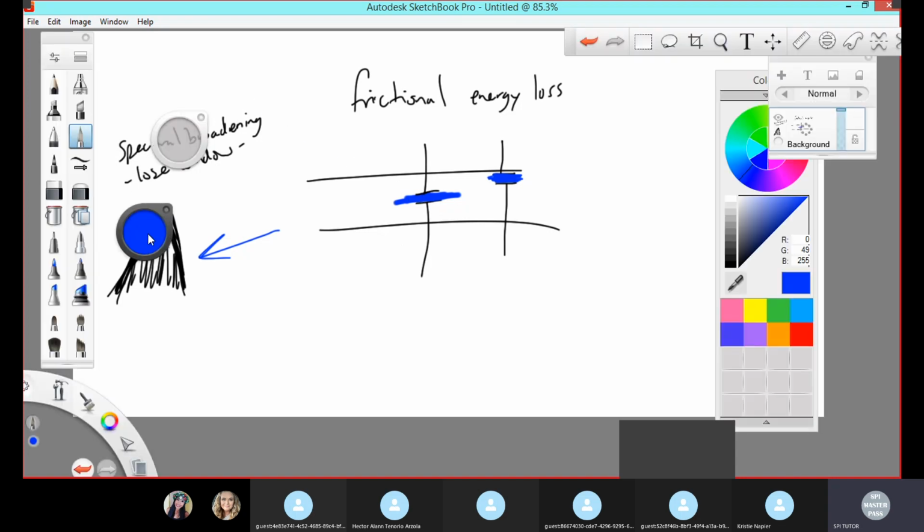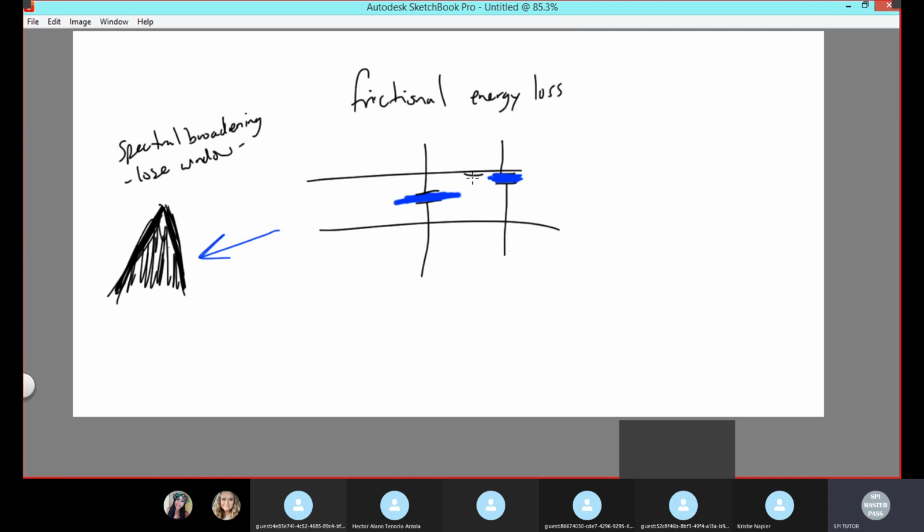Or another example is when you make your sample gate very big. Now you're seeing everything. So you are going to see the fast flow, but you're also going to see the slow flow close to the vessel walls. So your wave might appear bigger because you're seeing this fast flow, but you're still going to have turbulent flow because you're also picking up everything in between, including that frictional energy loss from the vessel walls.